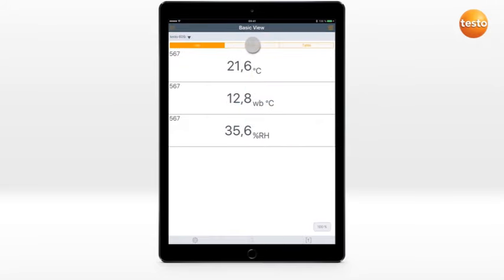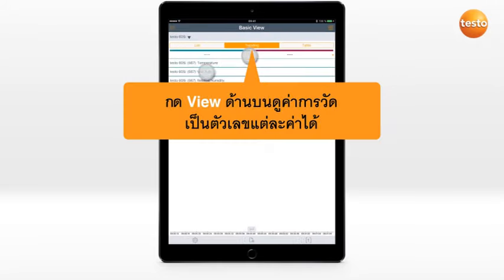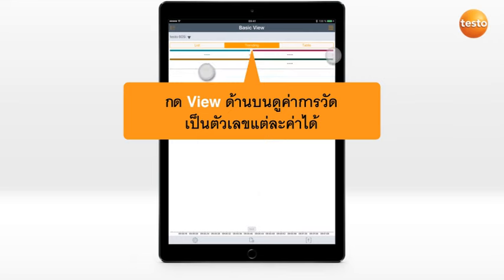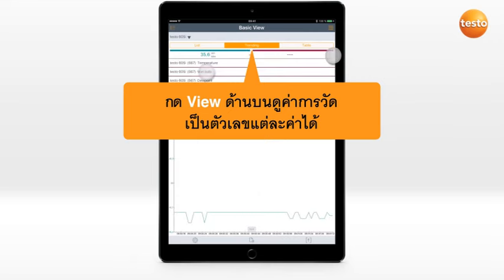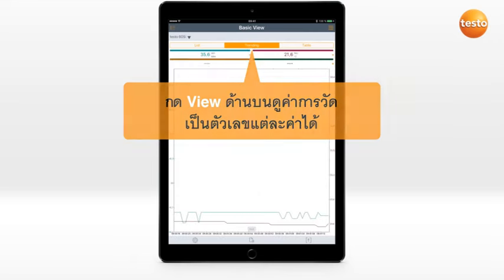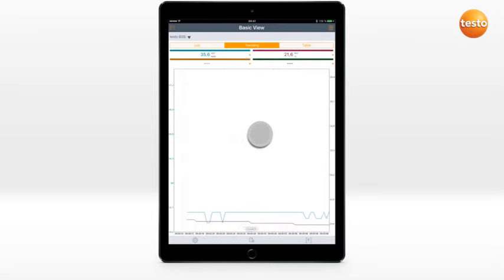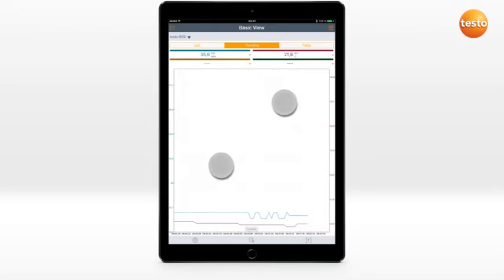Up to four values can be displayed in the Curve view. The measurement can be paused and the measurement value curve moved, enlarged, or made smaller.